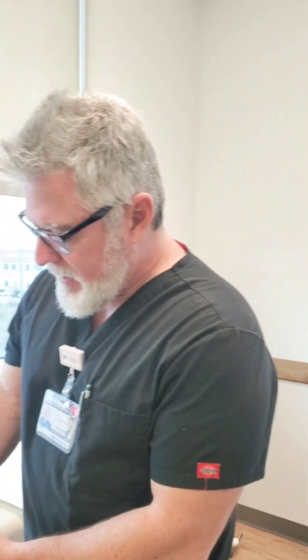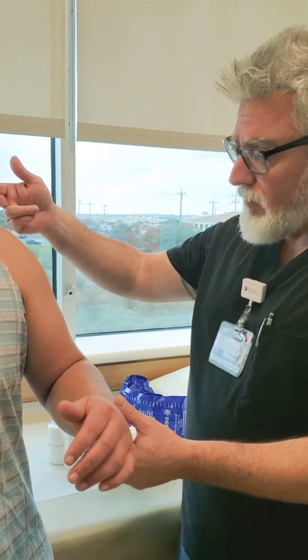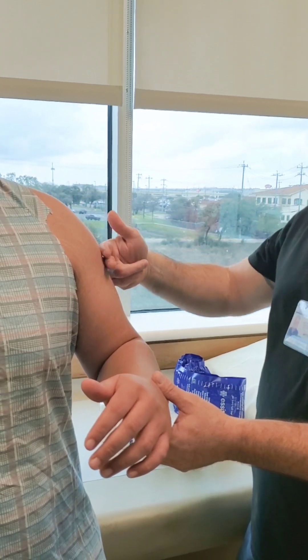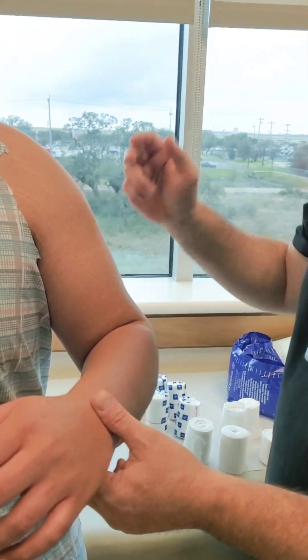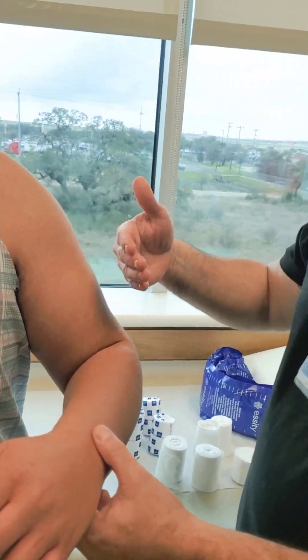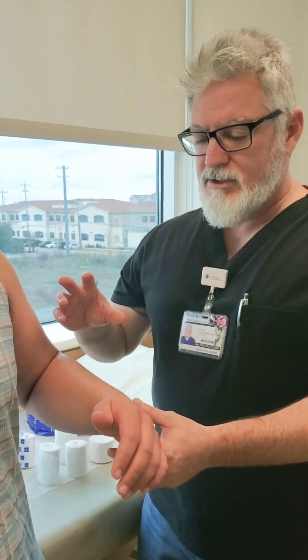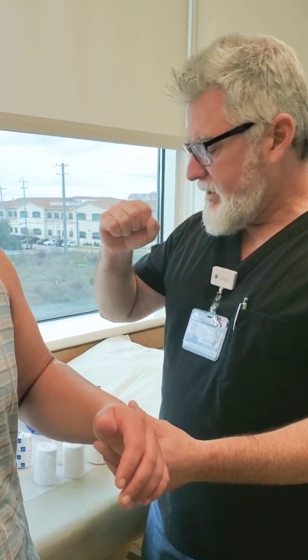A coaptation splint is a splint that you apply with ortho glass or plaster. You start it right at the AC junction, come down over the fracture zone — in this case the humerus — come underneath the elbow, underneath the olecranon, and all the way up to about two fingers from the armpit or axillary space. It creates a hard outer and inner shell to protect the humeral fracture.